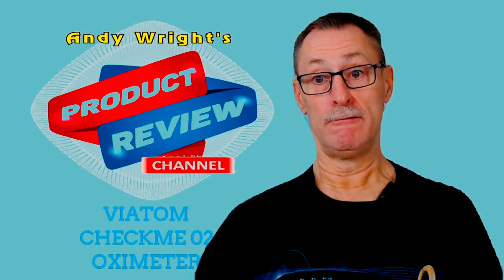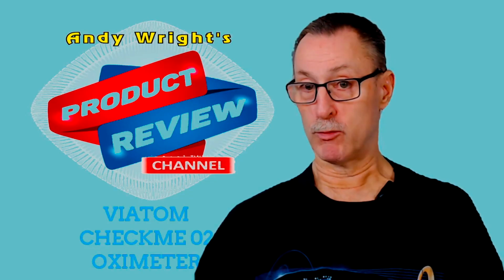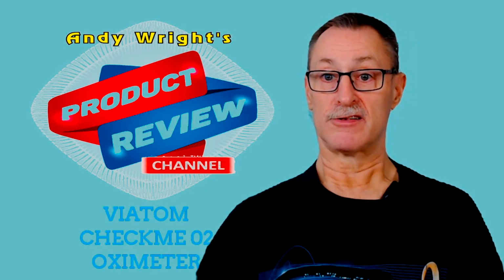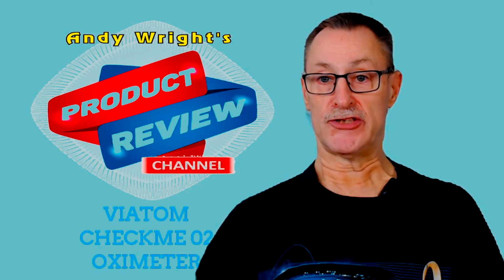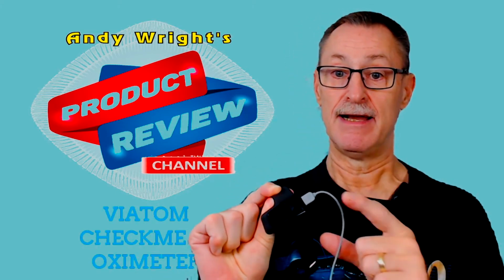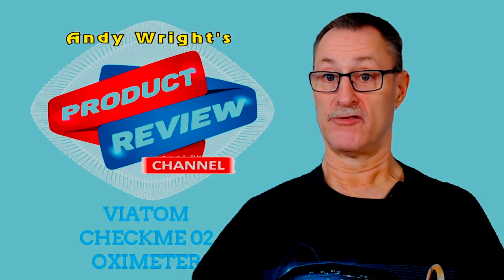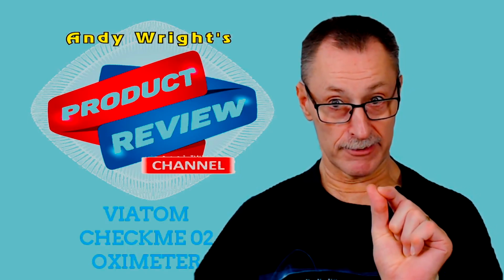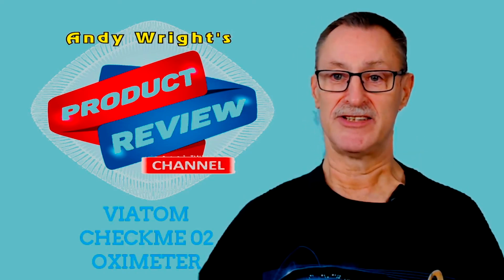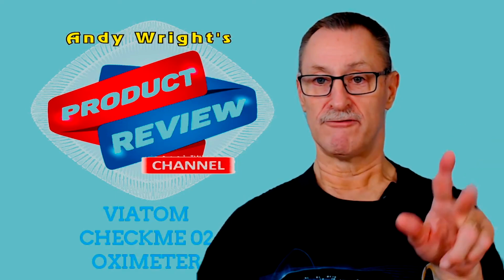A little tip for you, read the book, because, as they say, RTFM, because when you want to log into the app, you have to put the last 4 numbers of the serial number from the device. So you find that by taking the device out of the pouch, and the serial number is on the back of the device. It's very, very tiny numbers, mind you, so you may need to change your glasses, but it is quite small. So you put in the 4 digits.